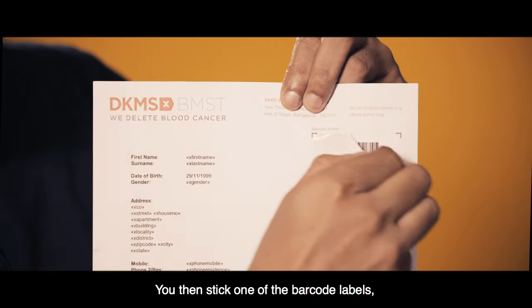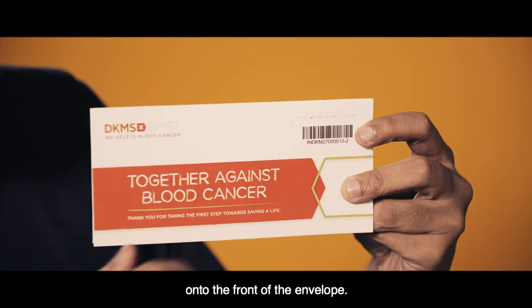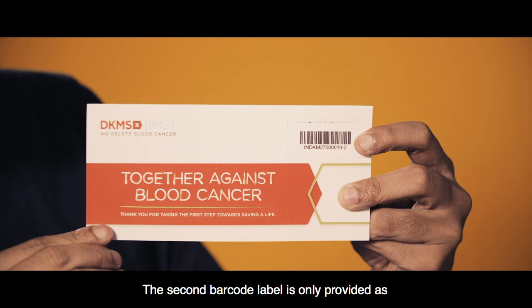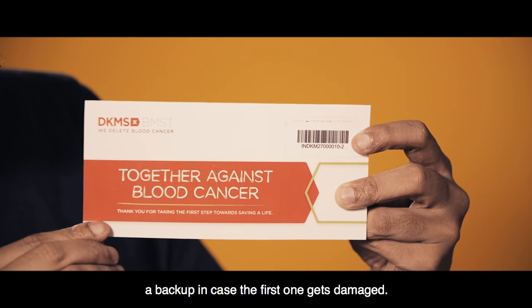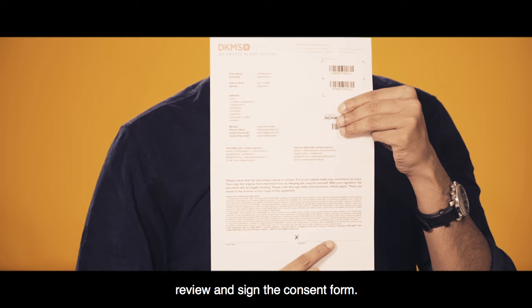You then stick one of the barcode labels, which has been provided on the consent form, onto the front of the envelope. The second barcode label is only provided as a backup in case the first one gets damaged. Also remember that you will need to review and sign the consent form.